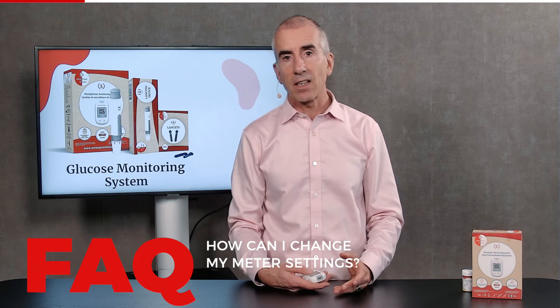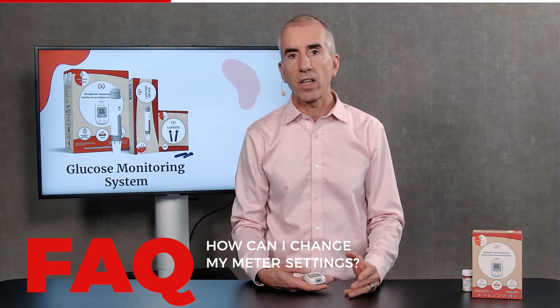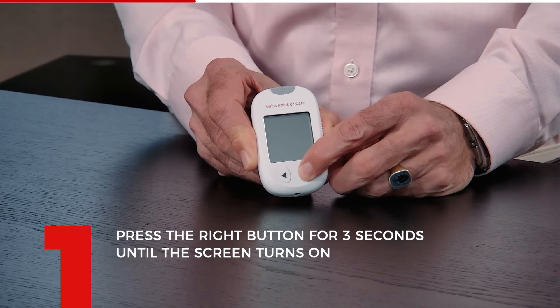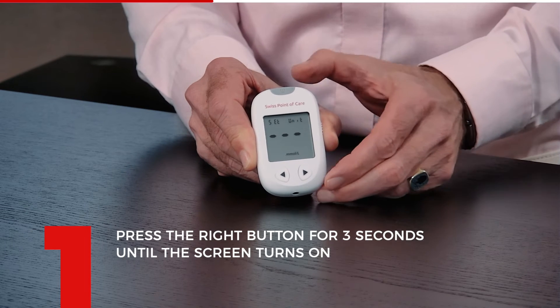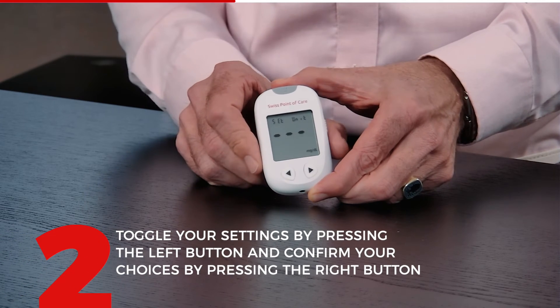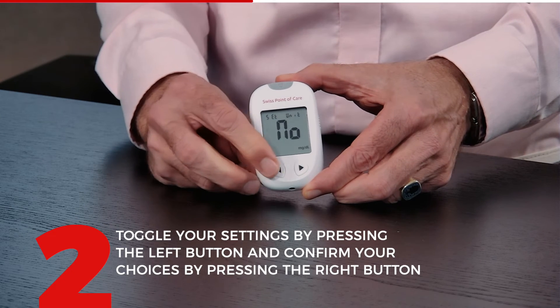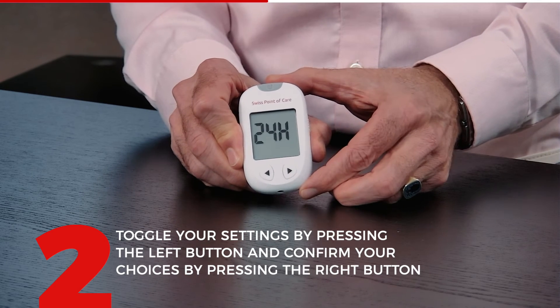If you have accidentally chosen millimole instead of milligram, or if you want to change your meal marker settings or other things, you need to go back into the setup. To go into setup mode, keep the right button pressed for 2 seconds until it turns on. You are now in setup mode. The first thing is you can change the unit — it says millimole. If I press here I can change it to milligram. Press here to confirm, and it says milligram yes or no — I'm going to say yes and confirm. Now the setting is changed to milligram.